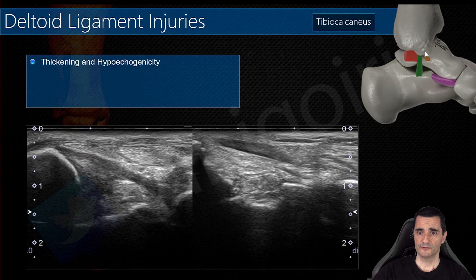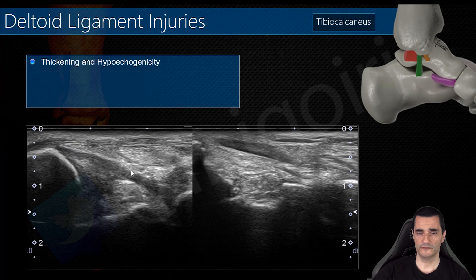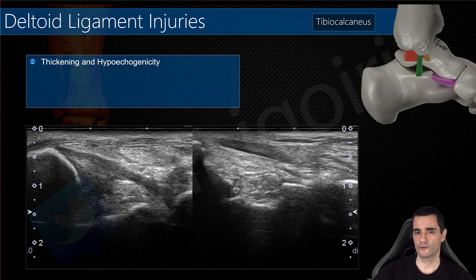The tibio-calcaneal ligament is the first we check. You can see here between the tibia and the sustentaculum tali this thickening and hypoechogenicity of the ligament, compared with the contralateral side. Remember that it is very uncommon to find an isolated single component affected while the rest of the ligament is normal — usually several components are affected.